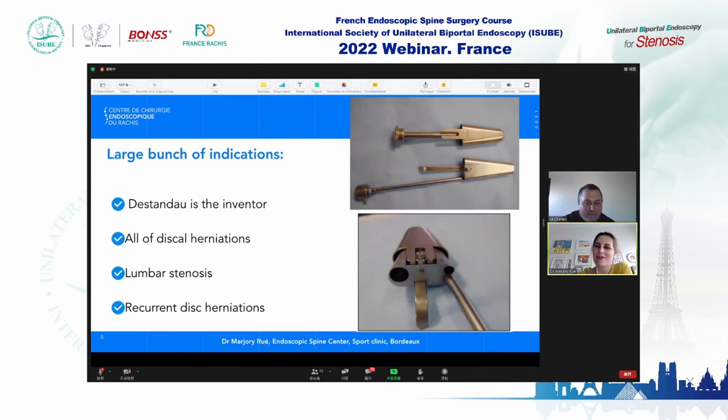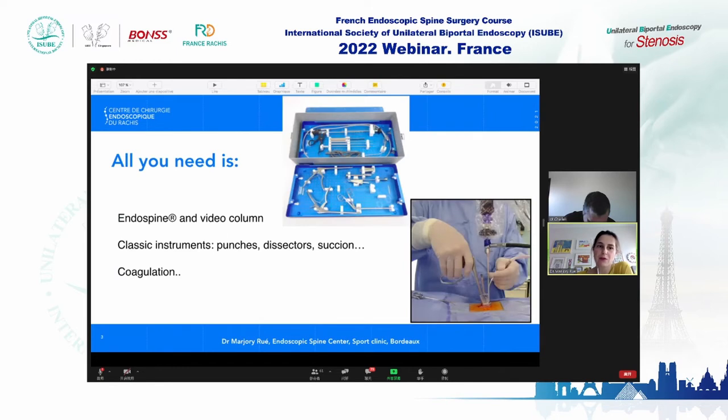With the Endospine, you can have a large range of indications: all disc herniations, lumbar stenosis, and recurrent disc herniation. You have a speculum and introducer, and the tool has three channels: one for the endoscope, one for suction, and one for all other tools. You also have a nerve retractor. All you need is that box with all the tools, the coagulation punch, the cable, the Endospine, and the video column.